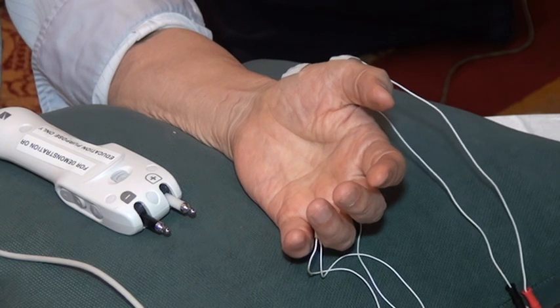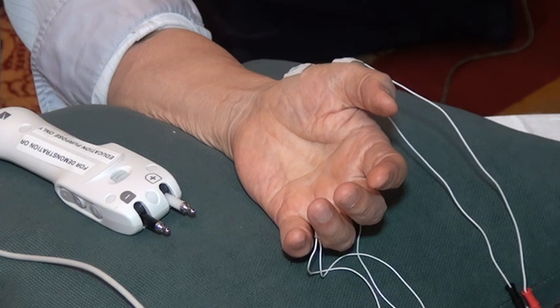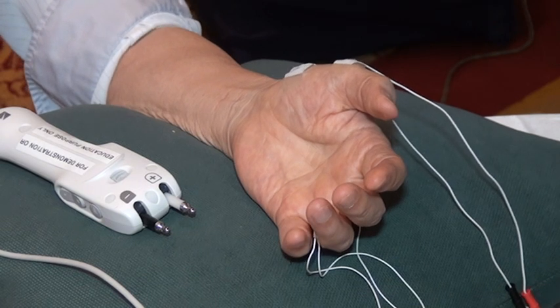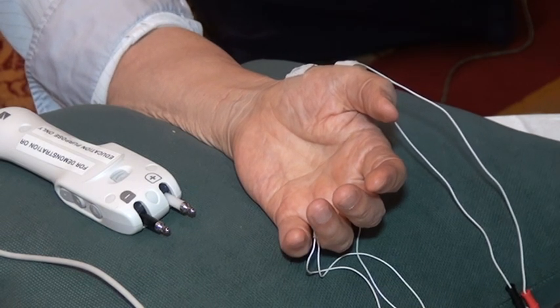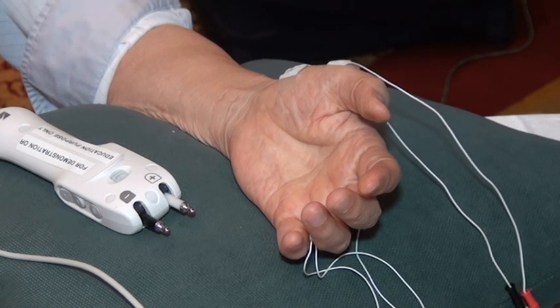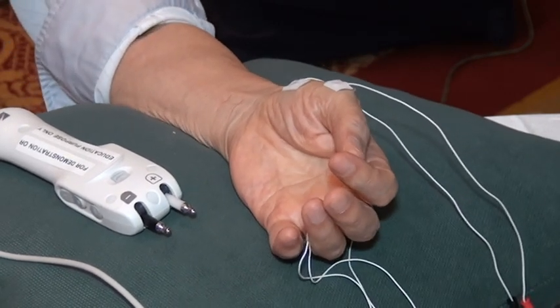Well, you don't accept it because this waveform, the initial one, and this waveform, the last one, are not the same. This is a short duration, and this is a longer duration, indicating muscle movement. I just showed you before I did that.